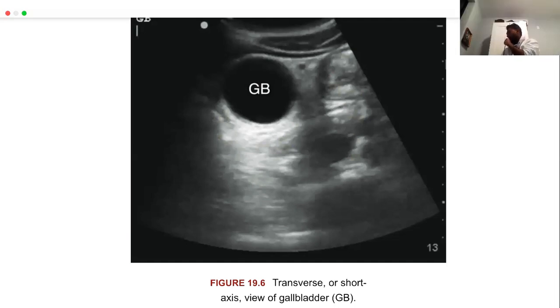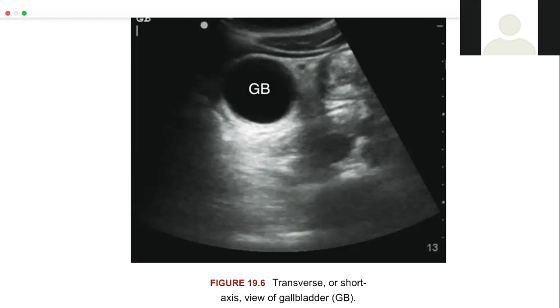Exactly. Whenever we're doing MRIs, or we're doing brains or whatever, we're not just going perfect axials. We're angling. For example, if I'm doing the forearm and I'm doing axials, I go perpendicular to the bone. If I'm doing sagittal, I plan the slices parallel to the bone. I don't just go along the forearm the way the skin is. Even if I'm doing, let's see, what's a structure that's angled.